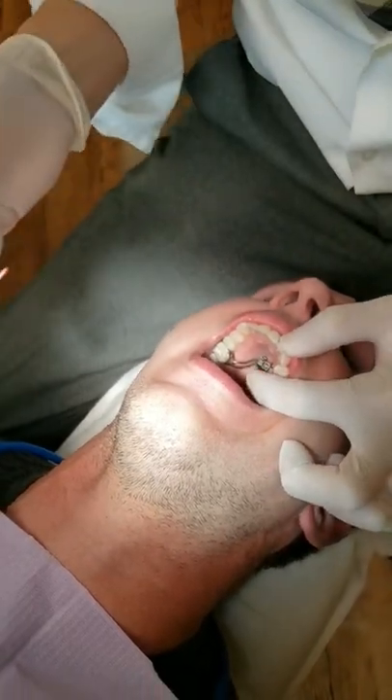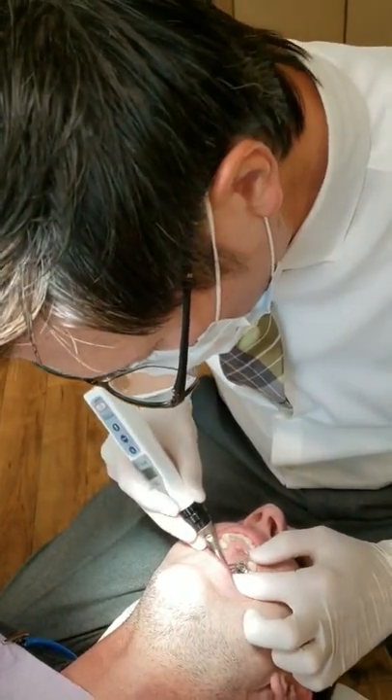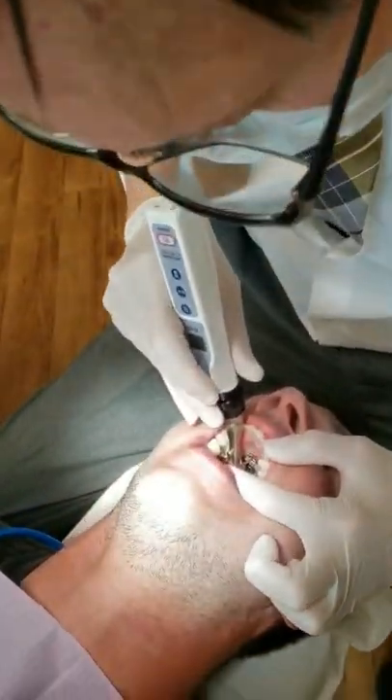When this handpiece goes in, you will feel the penetration of the cortex. Initially it will be a little bit difficult and then it will become easy — that's when you pull out the handpiece.